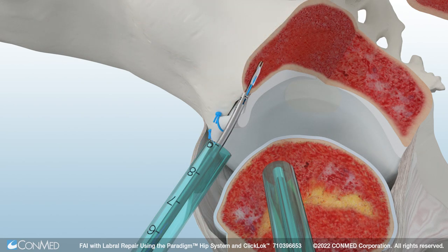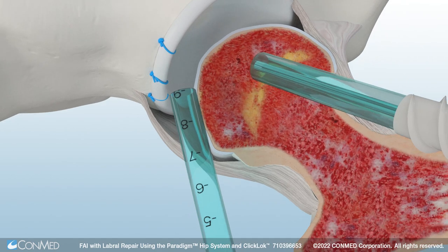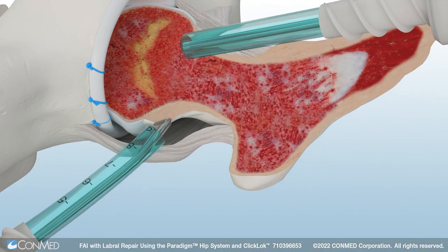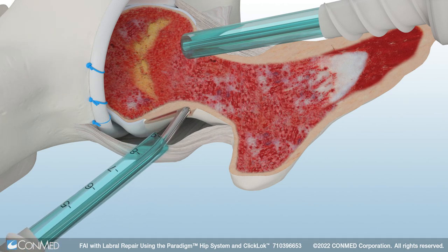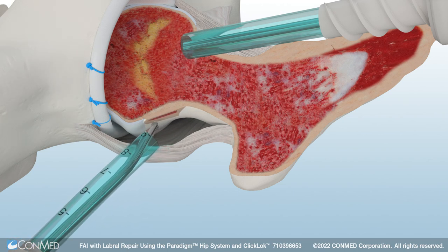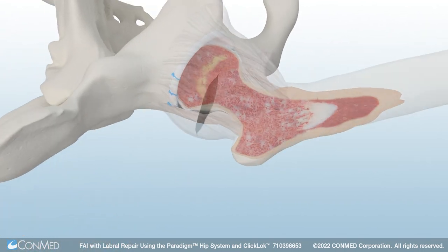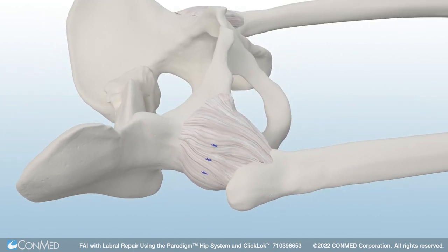A third anchor is placed and the sutures are passed and tied to complete the labral repair. With the repair complete, release the hip from distraction. Then use ConMed's pre-bent spherical burr to remove the cam bone. Now the hip capsule is repaired. The Paradigm Hip System isn't just a new hip system — it's a paradigm shift in hip arthroscopy.